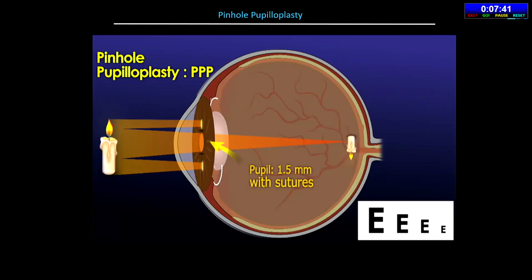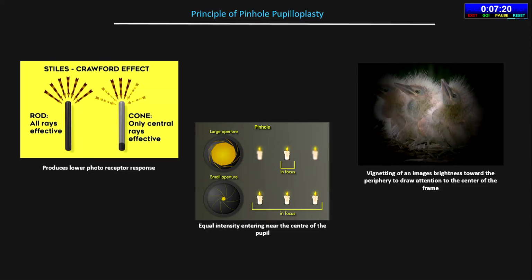What is the chord mu length? It is basically the distance between the visual axis and the pupillary axis. When you reduce that length, it helps enhance the vision quality, enhance the vision crispness, and removes all the higher order aberrations from the cornea which is passing through. So it is based on certain principles which we call the Stiles-Crawford effect.